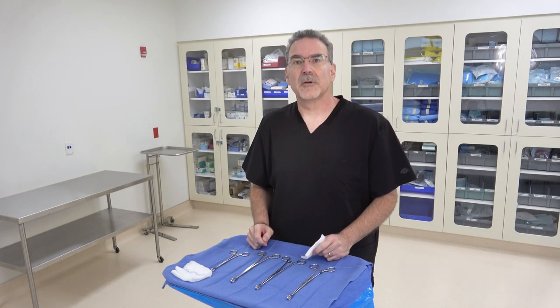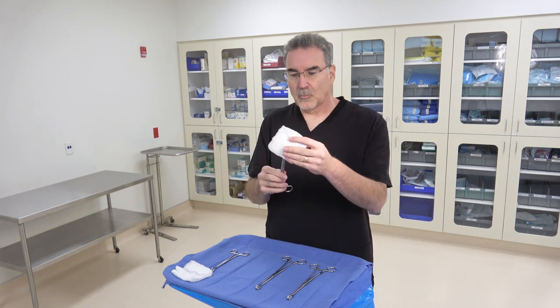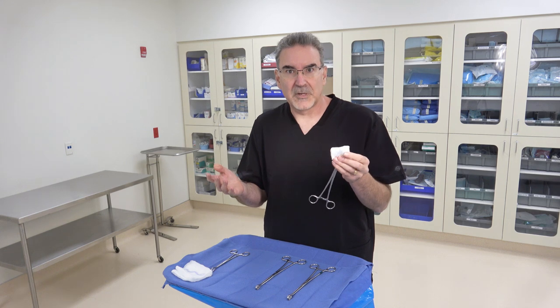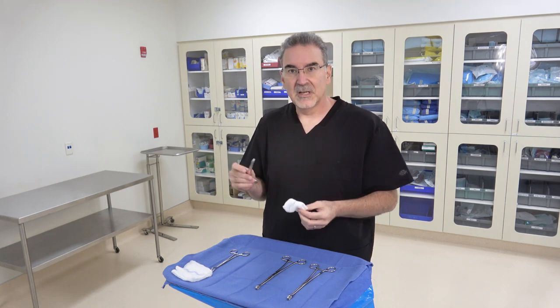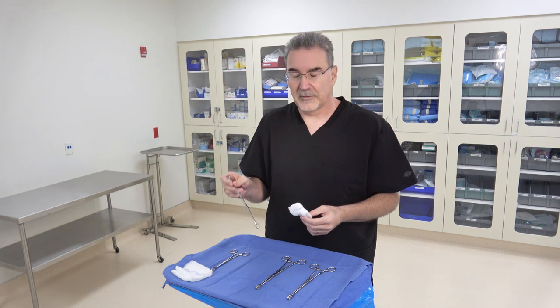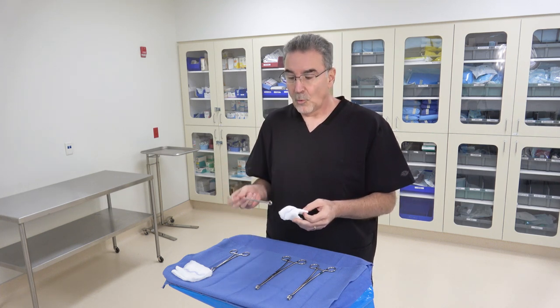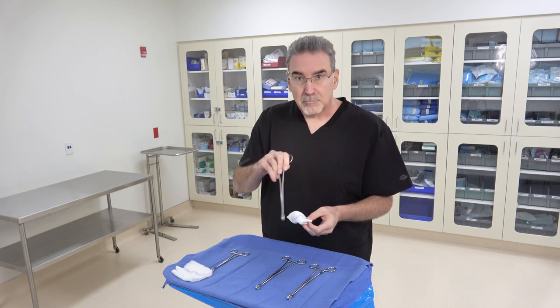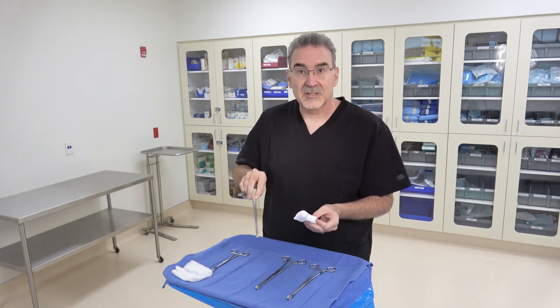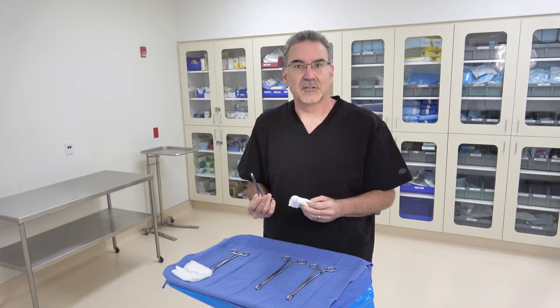I'm going to show you three different ways to create a sponge stick. A sponge stick is a Forrester clamp with the end wrapped with a RayTac so that it can be used for several different reasons: absorbing fluid in a wound, applying pressure to a bleeder, or most commonly for blunt dissection — giving us a soft tip to push tissue out of the way.